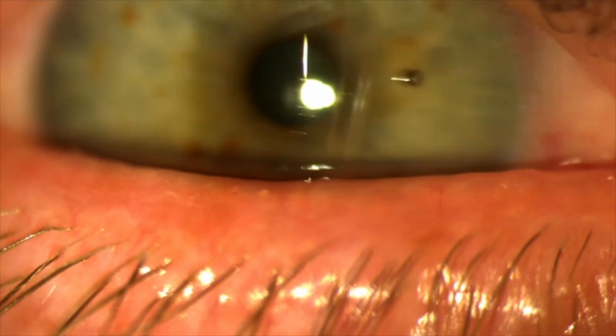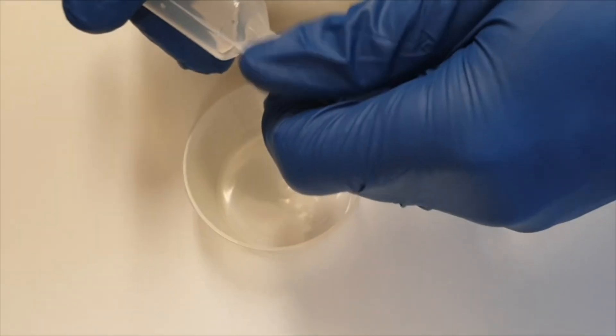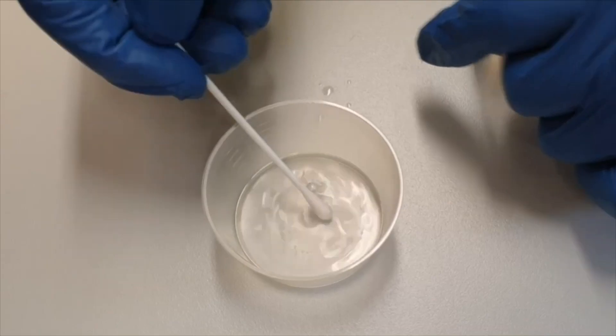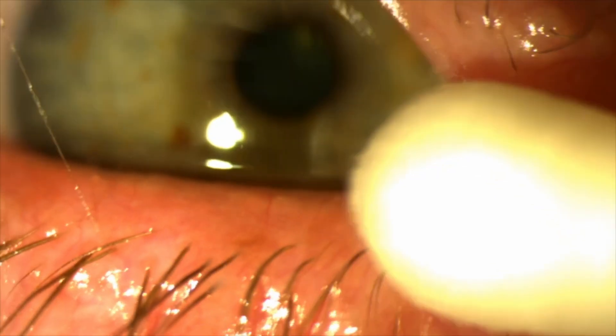Pause to explain again to the patient what you're going to do, reminding them about their head position. Moisten the tip of a cotton bud. Always initially approach using the naked eye — not looking down the eyepieces of the slit lamp or with your head torch.